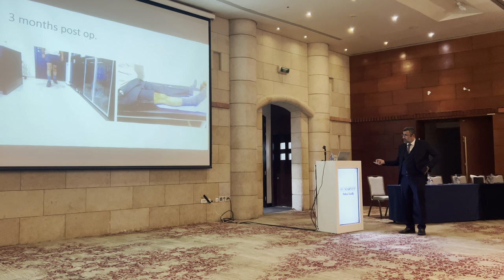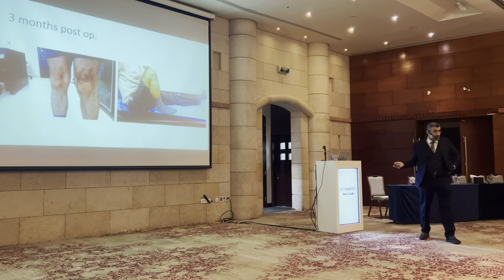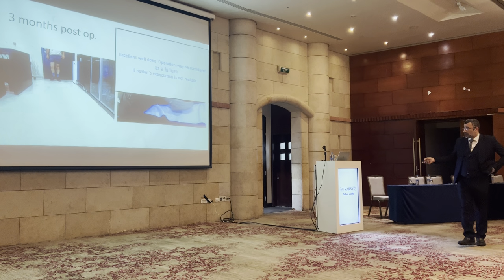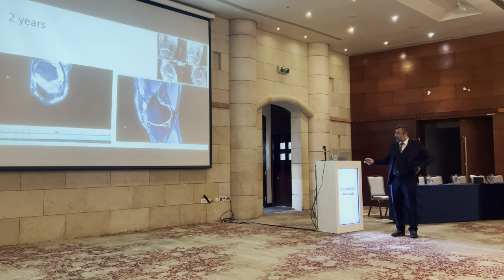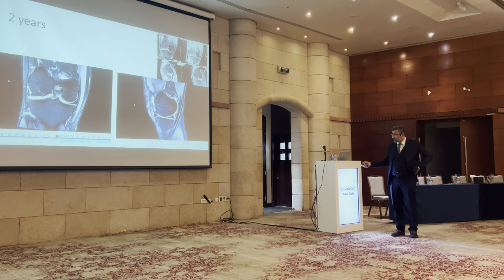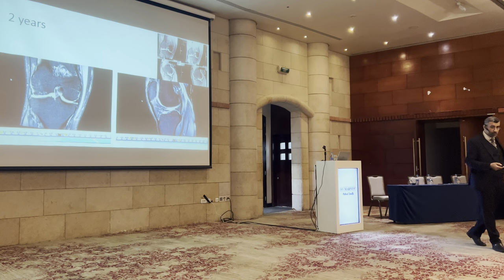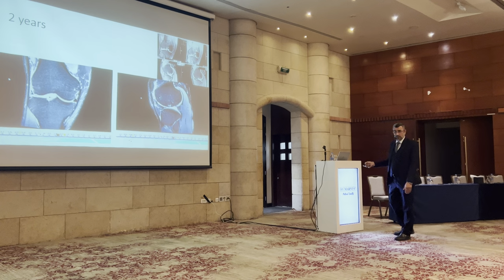Now microfracture of the lesion, and here the patient is 3 months after the operation. But what about the patient's expectation? He has lateral osteoarthrosis, he has a deficient meniscus, so he came back after 2 years complaining of pain. At 5 months, it will heal, but at 2 years he came back with pain. And we did MRI. Look here at the integration of the osteochondral graft. Looks good, look at the surface. But still he has some pain, which is much less than before, but because of the osteoarthrosis, which we already discussed with him, you may have pain in the future. And he was treated conservatively.